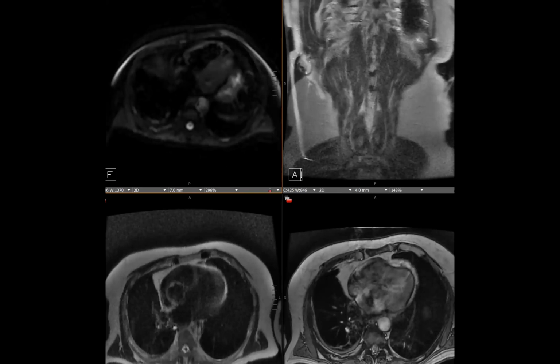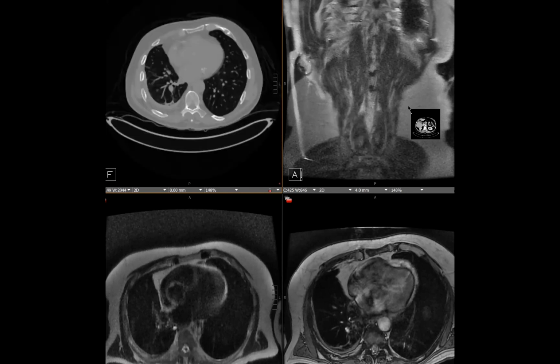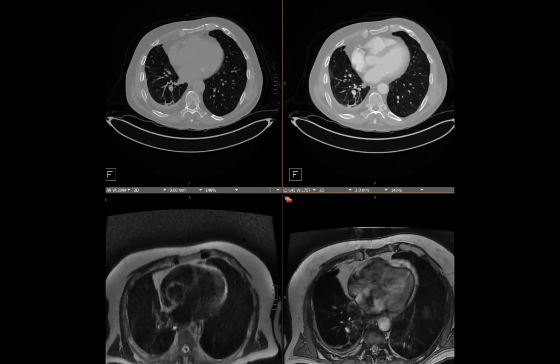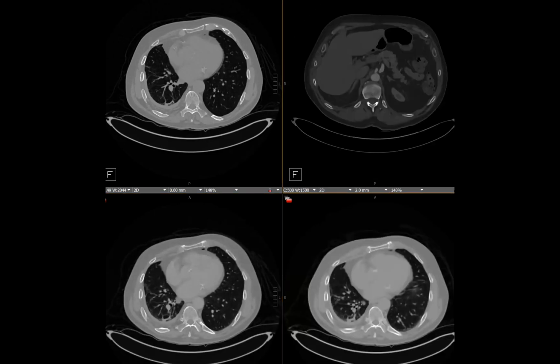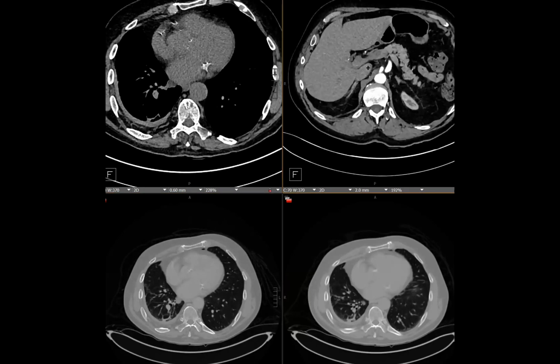Okay. So this next patient had a renal lesion that we've been surveying, and the patient was being routinely surveyed, and I read the follow-up exam. I thought it was interesting because it was a companion case to a previously presented case of what I think this is. The study I read was a follow-up exam, like I mentioned. There's a non-con, arterial, I think it was a urogram protocol. And the lesion that we were looking at was this lesion here.